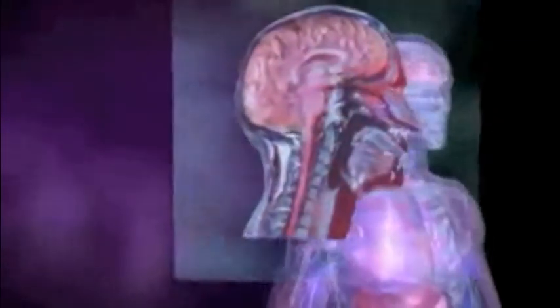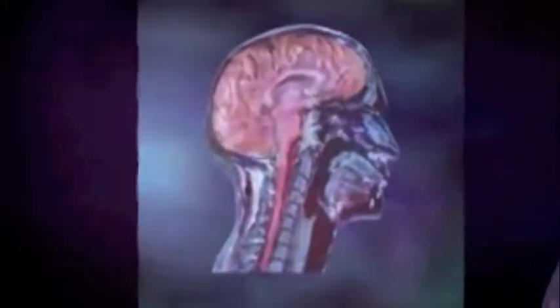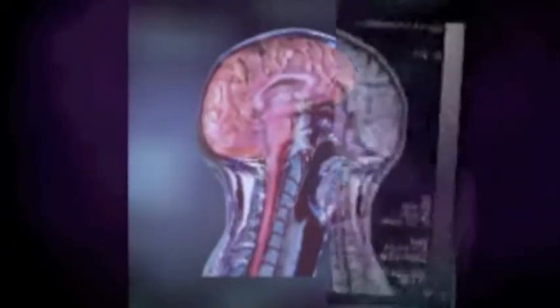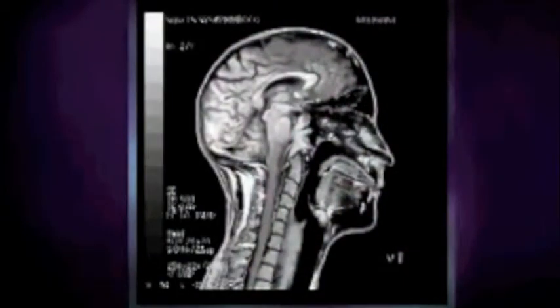In the MRI machine, the gradient coil is used to vibrate the water molecules at a slightly different Larmor frequency so that each individual part of the body can be identified when using the MRI machine. This is what makes the image possible.